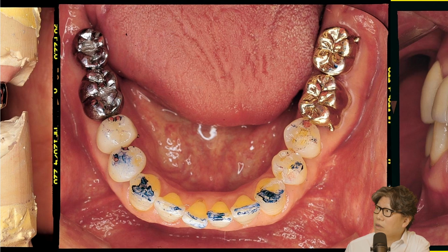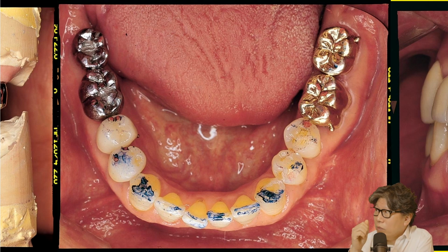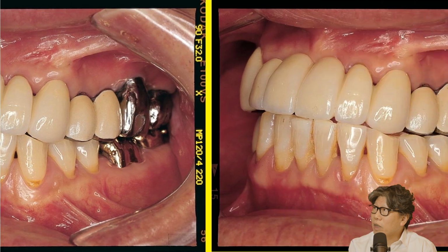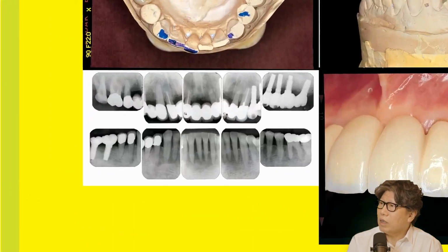You know, natural teeth have a lot of these wear surfaces. So now I need to create a wear surface on the occlusion, and I've given it a groove and made it multiple points. The original tooth was worn, right? But if you reflect the wear surface as it is, it will be overloaded. So I think I made it by reducing the occlusal area, but forming a groove or fissure with multiple points. And that's how it ended up. So I think that's why it was okay.